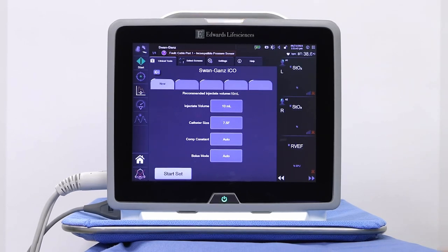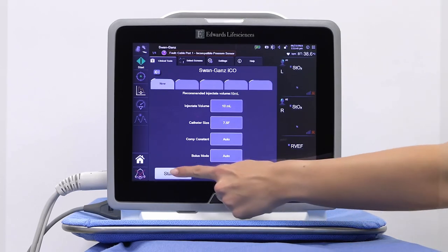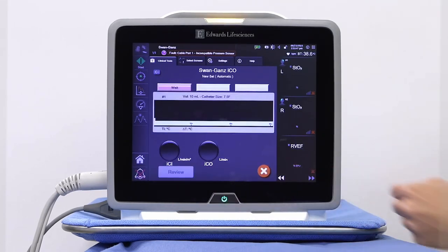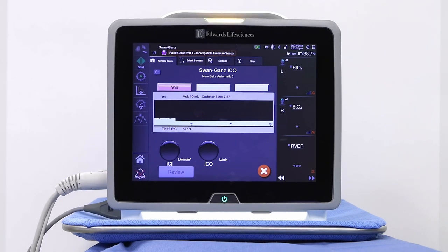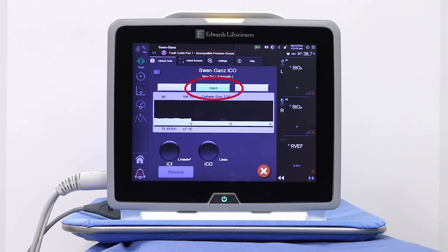Touch the Start Set button. The ICO screen will appear. If you have selected Auto for the bolus mode, you must wait for the green Inject icon to appear. Once it appears, you may inject your first bolus.